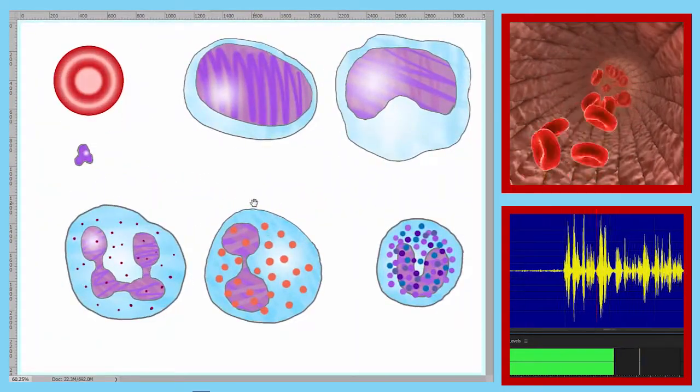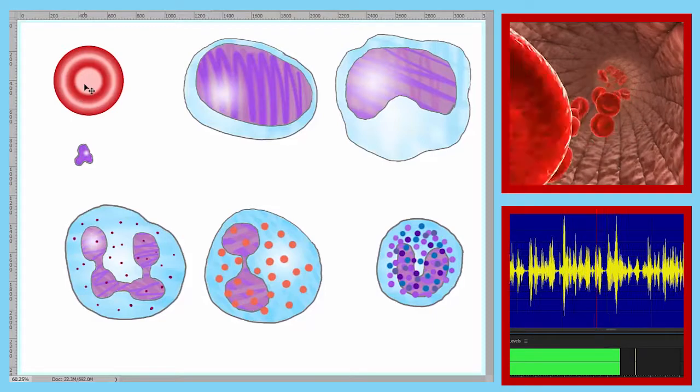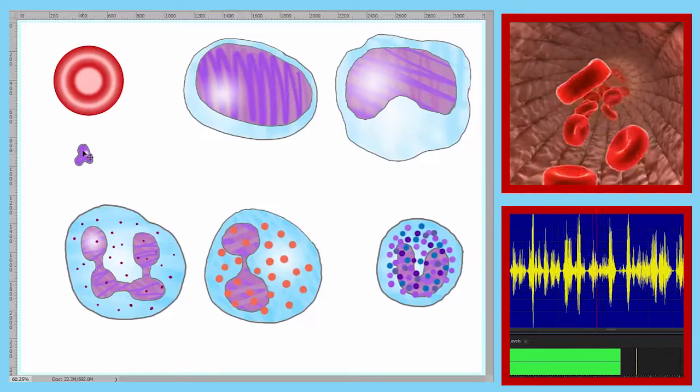And so here we've represented the 7 formed elements that you will see if you look at a blood smear under the microscope. Let's go over those again. The first one here is a red disc. There are millions of these red discs. This is the most abundant formed element. The next one here is the cell fragment. We've seen this one already.